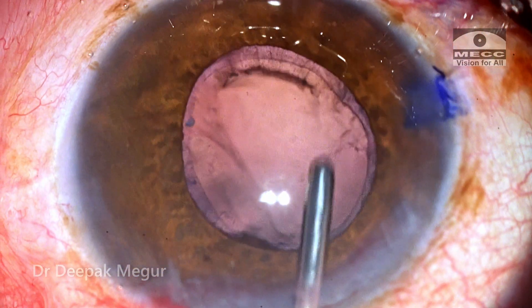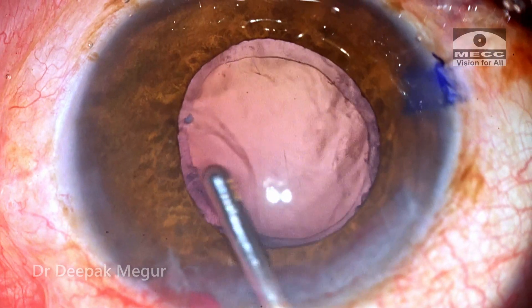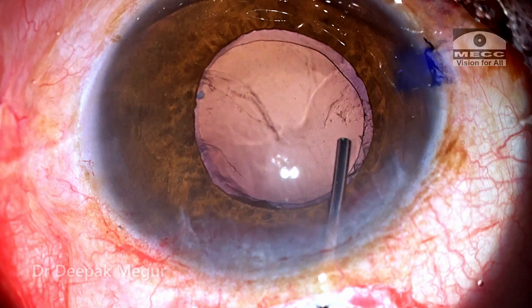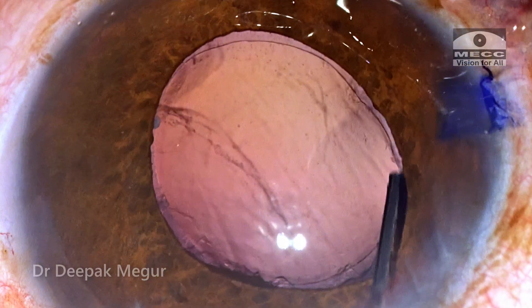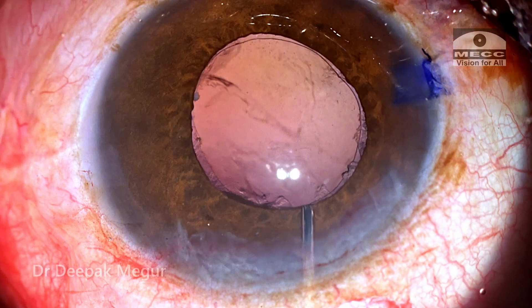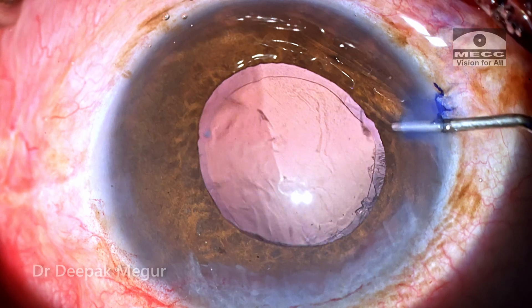I'm irrigating the capsular bag with BSS to loosen up some of the fibers which could be sticking to the posterior capsule. Using the hydrodissection cannula, I'm squirting BSS at the cortical fibers sticking to the posterior capsule. Gentle flushing of the posterior capsule with BSS releases those cortical fibers, and the capsule looks quite clean now.